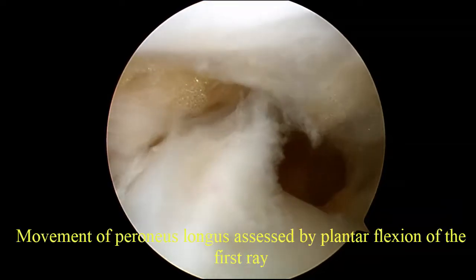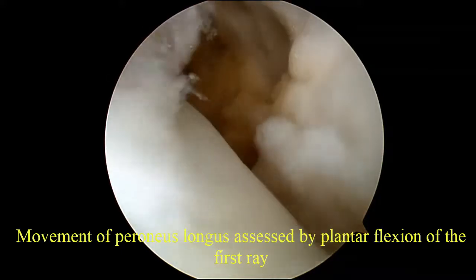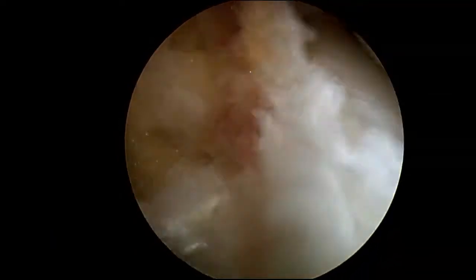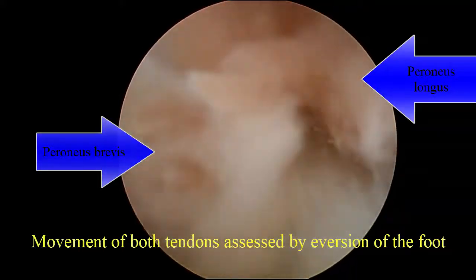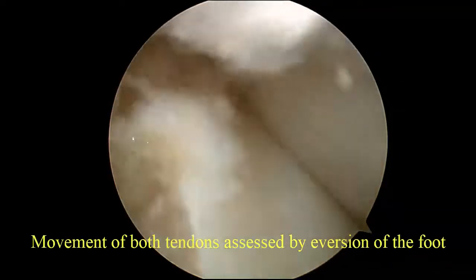After the completion of the procedure, the movement of the peroneus longus was assessed by the plantar flexion of the first ray. Movement of both the tendons was assessed by the eversion movement of the foot. The gliding movement of the tendons was assessed by circumduction of the foot and ankle. During the circumduction movement, there was no subluxation or dislocation of the tendons.